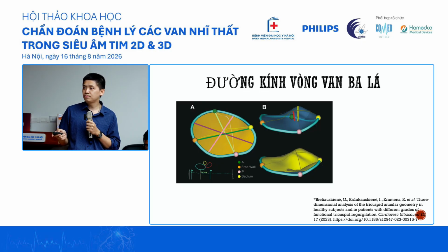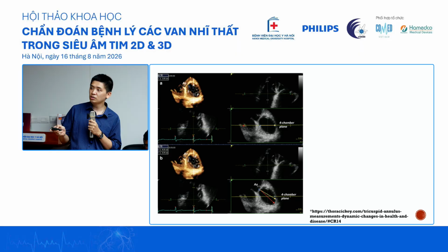So that's why the tricuspid annulus is actually important. Here you can see a diagram of the tricuspid annulus. The green one is anterior, this one is posterior, this is septal. Usually what we measure is the light purple here, but the largest we can measure is actually this one, from the anterior septal commissure to the posterior leaflet. As you can see on the diagram, this is what we measure, but this is the biggest one that we can actually measure. So in surgery, they will measure this one, and we will measure this one.